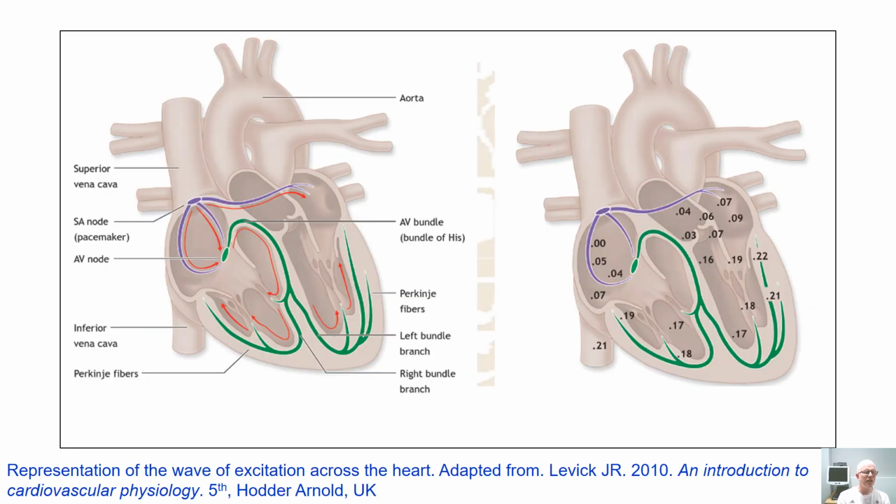So let's think a little bit about what the ECG is showing us. So let's dig inside the heart. And the two panels here are really showing the same thing in many ways, but what they're depicting for us is this wave of excitation that I was referring to, and the key structures that are engaged as a result of this wave of excitation.